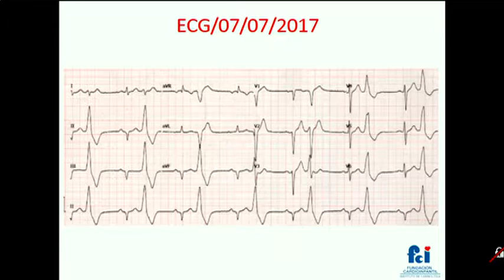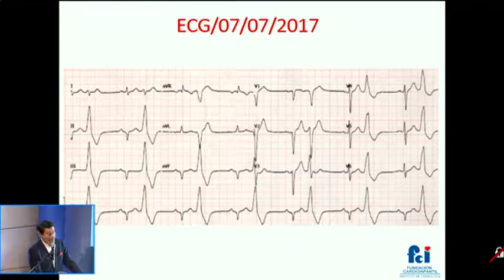We're going to go further into the description of the ECG. As you will see through the day, this is the key step when we are planning what we are going to do in the OR. Let's say that one of the basic tips is not to fully analyze the extrasystole initially. Let's analyze the sinus rhythm first. The sinus rhythm is telling us the story of the patient, whether the patient has heart disease, and this is what we intend to do initially.